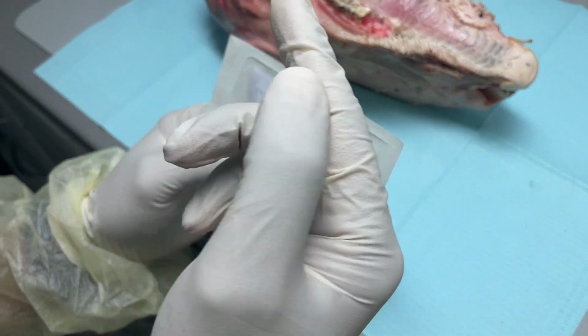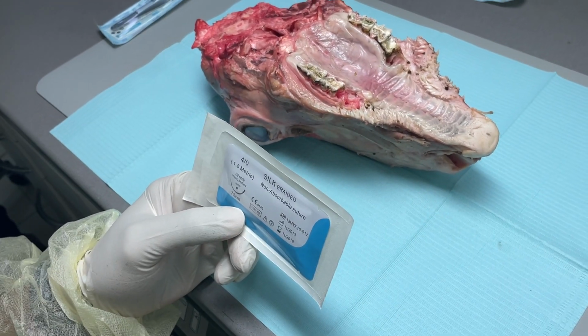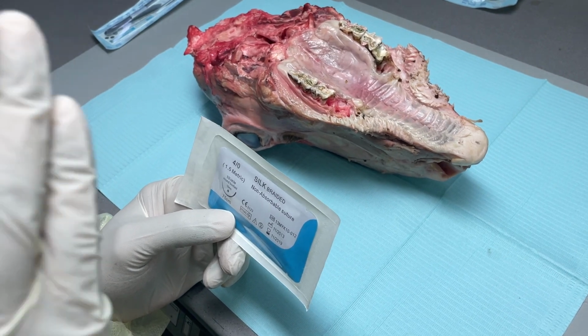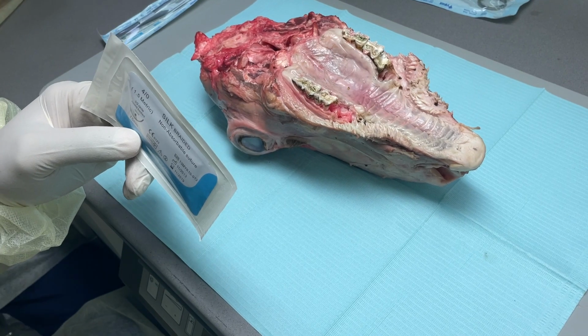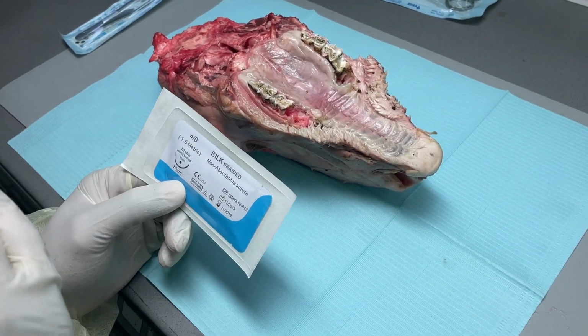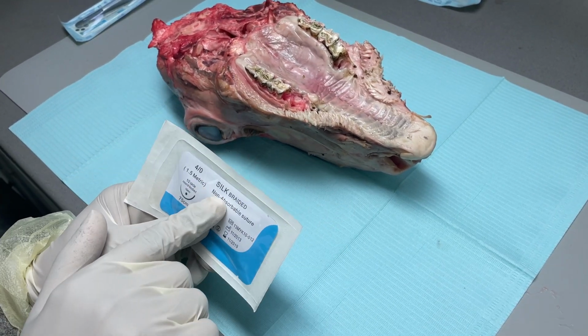40 means that is the needle size we use. If it becomes 50, 60, it is a thinner, smaller needle. If it becomes 30, 20, it is a thicker, bigger needle, like we use in general surgery. In dental we use 30, 40. Plus, it is silk.